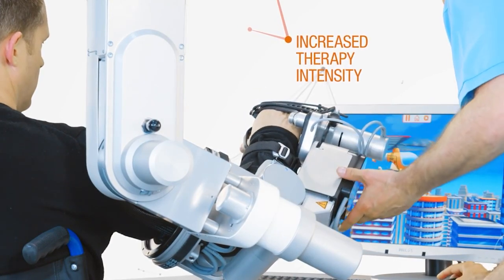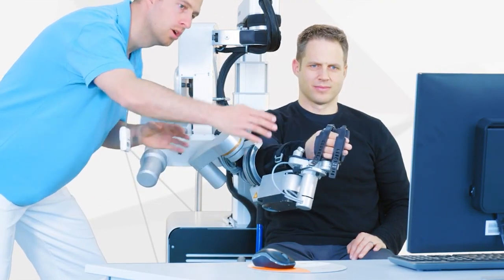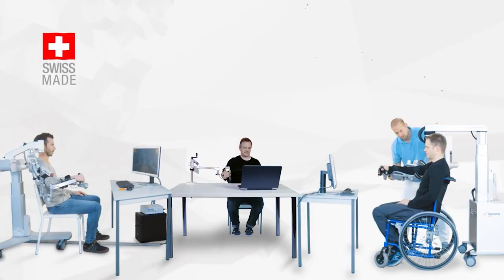Thanks to easy handling, quick setup, and patient guidance through intuitive software, clinicians can maximize the volume of intensive therapy through self-directed training and group settings.